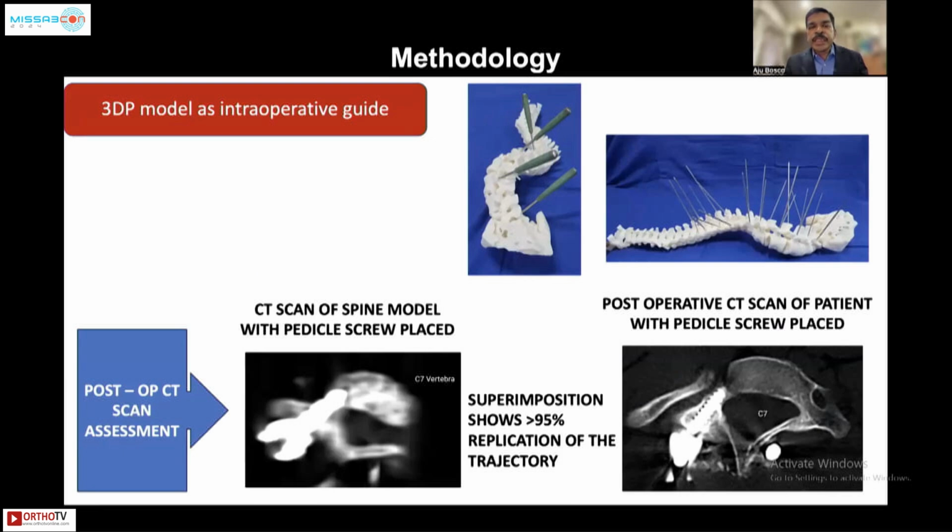As soon as we take a CT scan of the model, we just remove the screws, pack the holes with bone wax, and use trackers or markers inside the screw holes, which serve as a guide for the surgeon. And the accuracy is somewhere between 0 to 5 degrees cephalocaudal and mediolateral, and some amount of eyeballing is definitely involved.